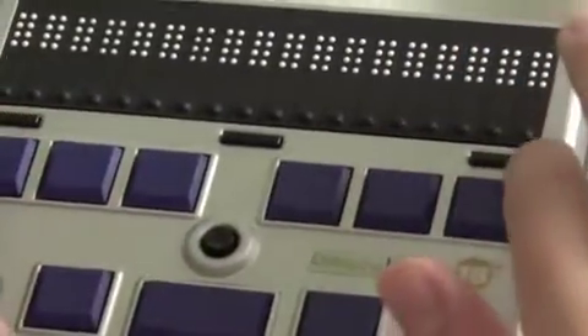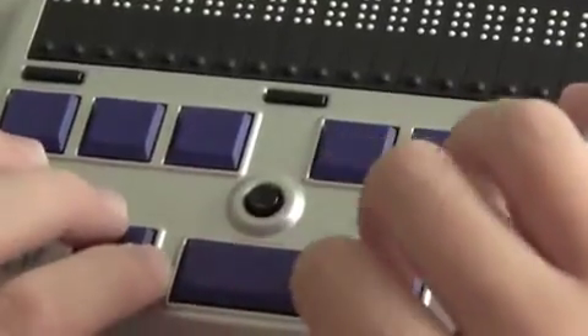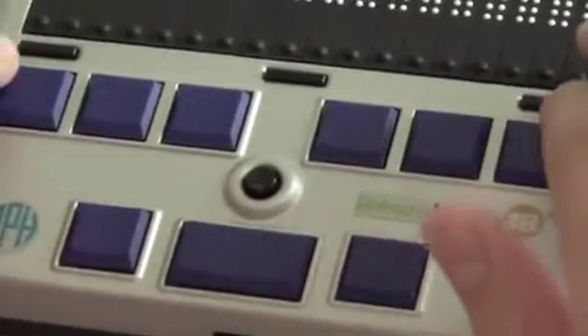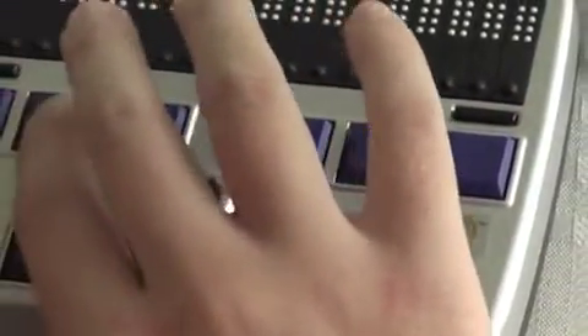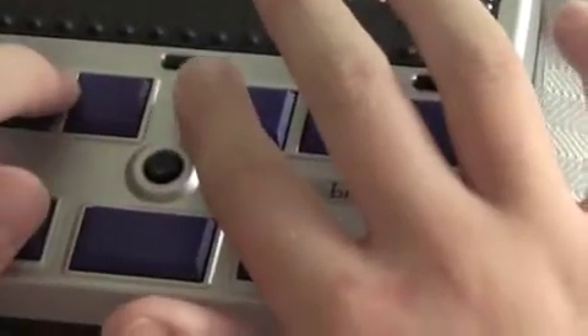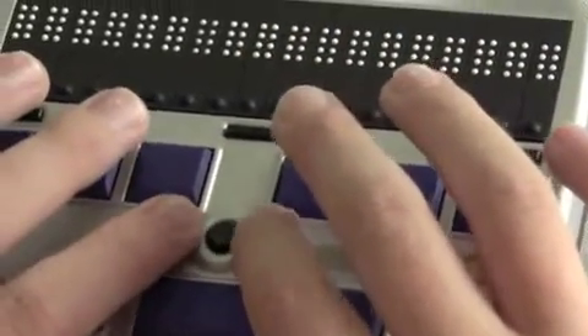Below that are your six Braille keys, and your shift, space, and control keys. As usual on a Braille display or Perkins Brailler, from left to right these dots are dot 3, dot 2, dot 1, dot 4, dot 5, and dot 6. As also normal, there is a small space between dot 1 and dot 4.